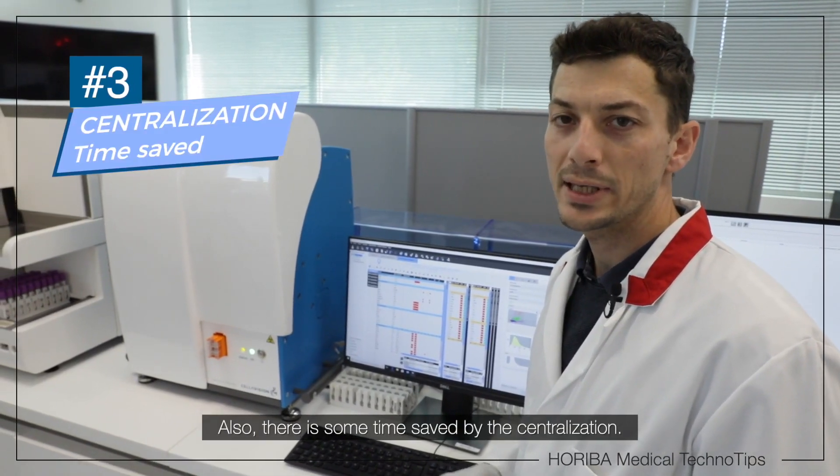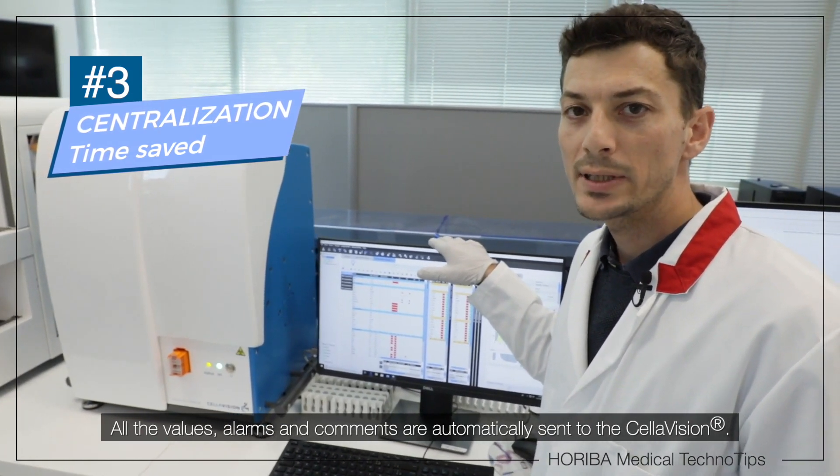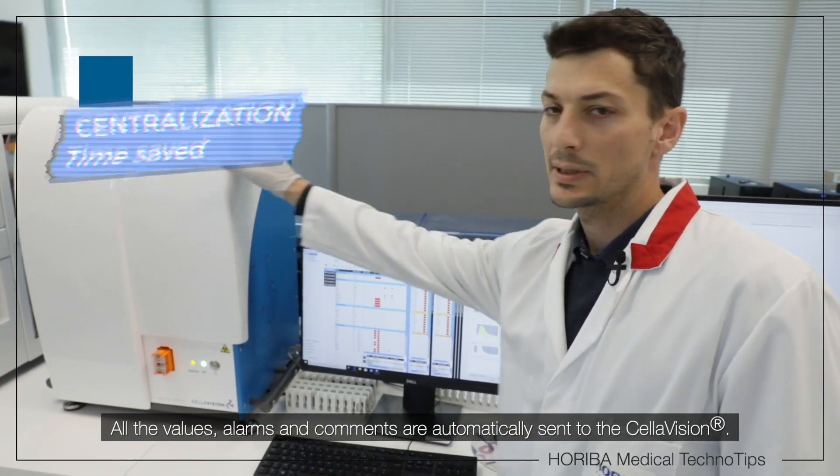Also, there is some time saved by the centralization. All the values, alarms, and comments are automatically sent to the Cellavision.